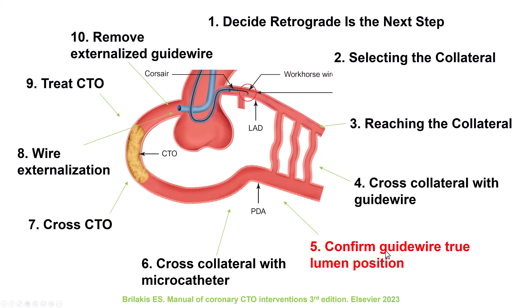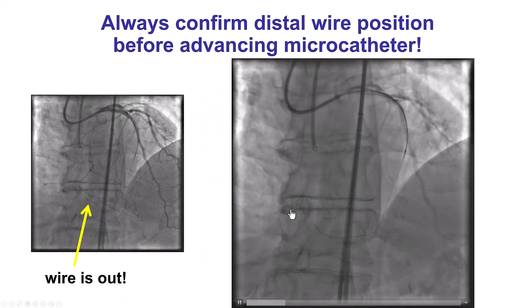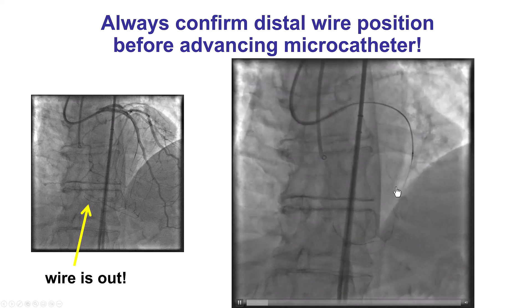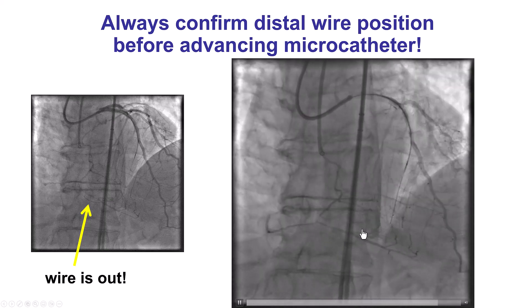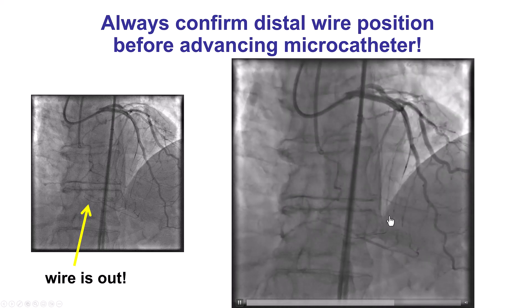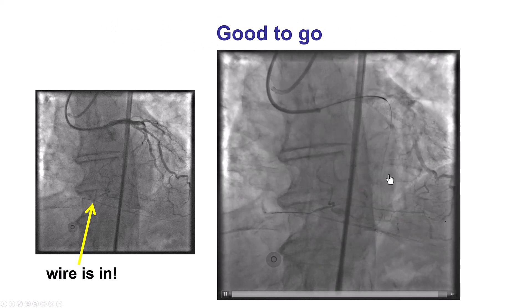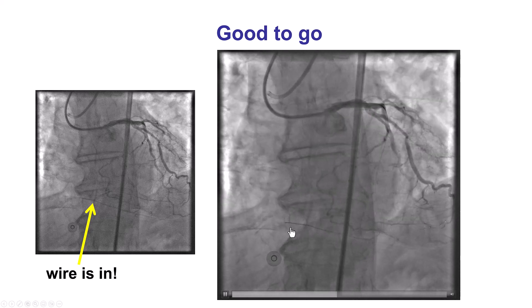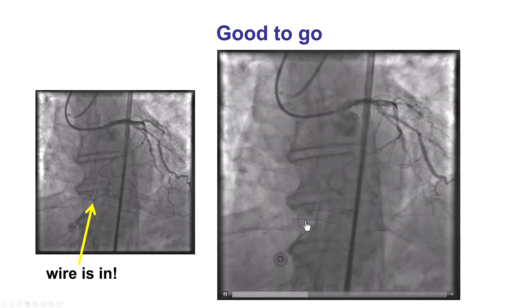Step number five is to confirm that the guidewire has entered into the distal truelumen, and this is done by injecting contrast from the donor vessel. This is a critical step. This is an example of a patient with a right coronary artery CTO where we're trying to cross retrograde through a septal collateral. Although the wire initially seemed to be in the right place, when we do the injection from the donor vessel, it becomes clear the guidewire is not inside the distal truelumen. The wire was redirected, and the subsequent injection confirms it is indeed in the distal truelumen in the PDA and distal right coronary artery. It is critical to confirm this before advancing the microcatheter.